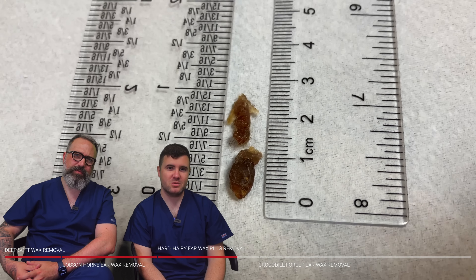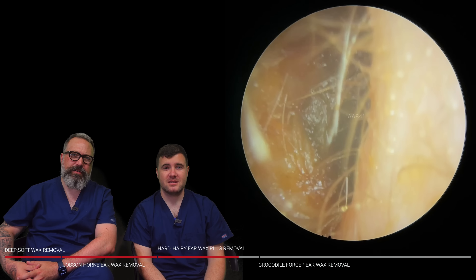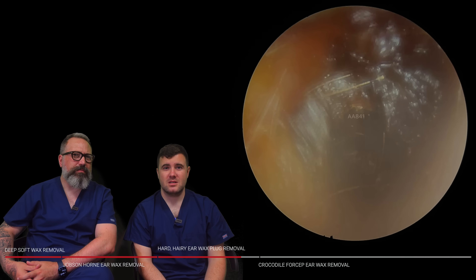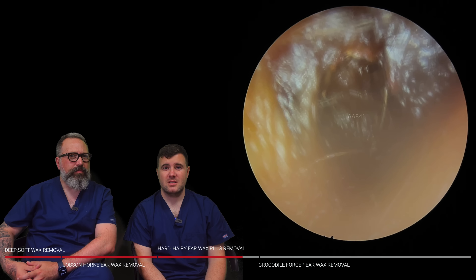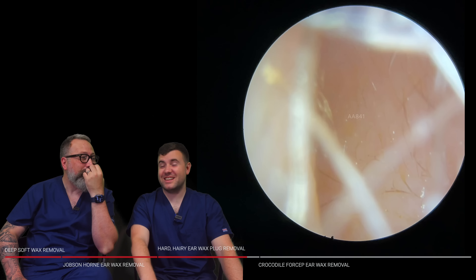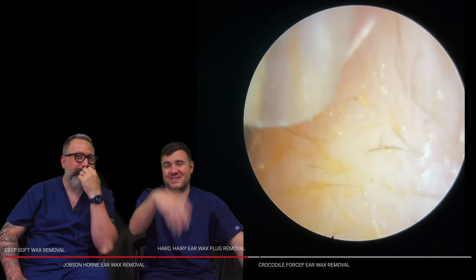It was really polar opposite now. Very, very dark wax, very hard wax, lots of hair in here as well — a mixture of everything you don't want to see. So just giving it a little wiggle. This is a standard size Zoellner tube in here as well, guys, just to take this bit away.